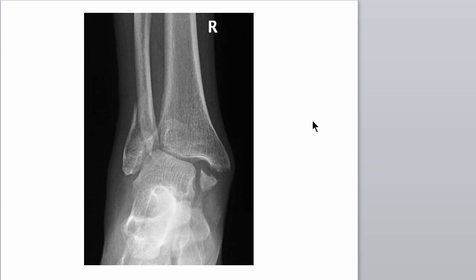Last one — see it? Of course you see this. You guys spotted the transverse process fracture, so you can spot this. So that was the medial malleolus fractured — this is an avulsion fracture. Somebody sprained their ankle so bad that the ligament ripped the tip of the medial malleolus right off the bone. And they have a fracture through the lateral malleolus here. So this was an eversion sprain. Usually you have inversion sprains where you get an avulsion of the lateral malleolus, but this went the other direction — it jammed the head of the fibula up and actually fractured it. The ankle twisted that way, pulled so hard here that it snapped the medial malleolus out and fractured the lateral malleolus.